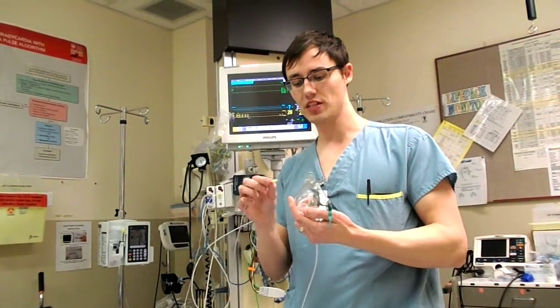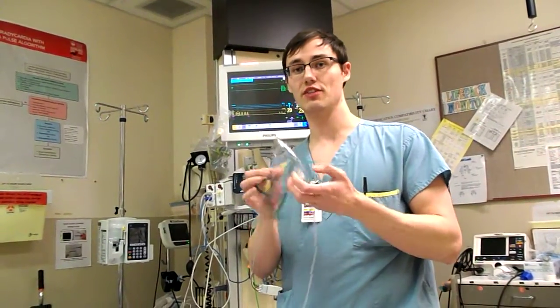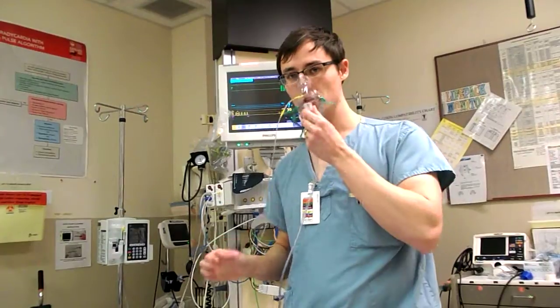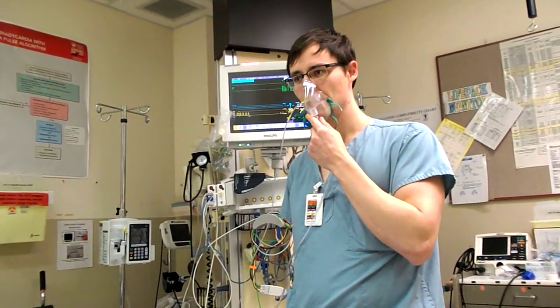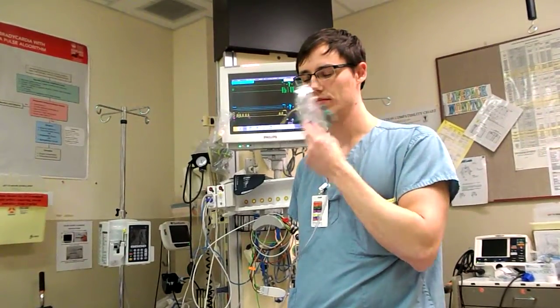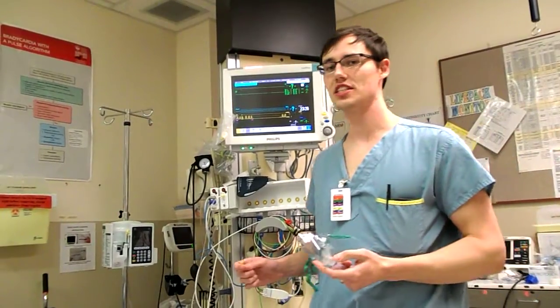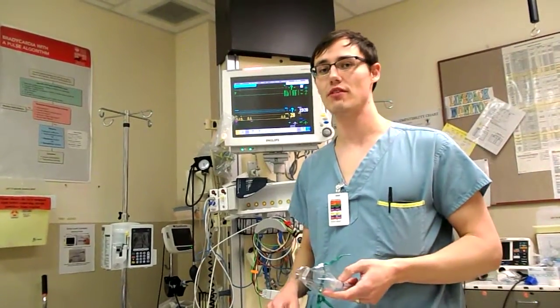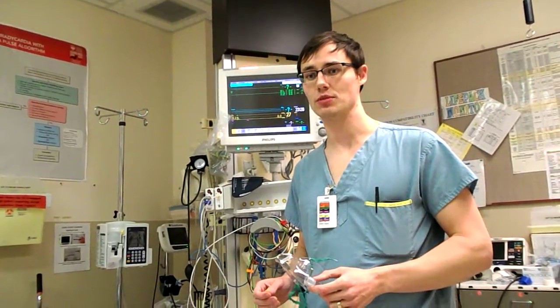You can also use it for the face mask — it just fits into one of the small holes that's already on the side of your Hudson mask or your non-rebreather. Again, you can see that it picks up really well the waveforms. I've actually tried it out where you're breathing a little more shallow, like in a patient who's sedated, and it still does a great job of picking up the waveforms.